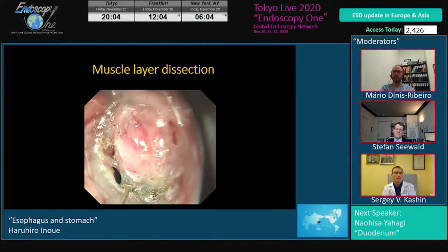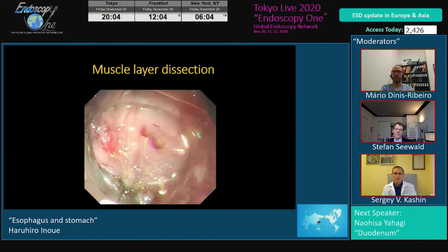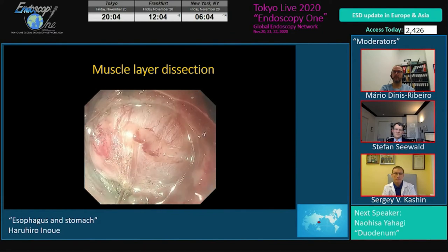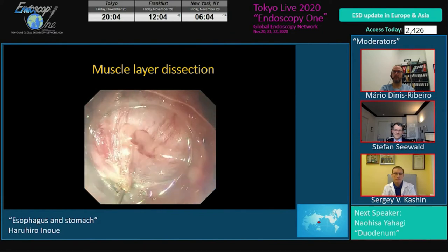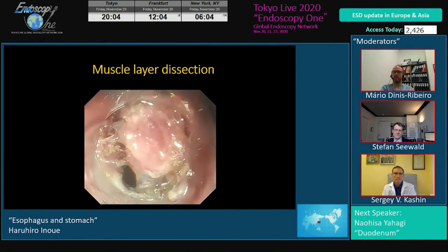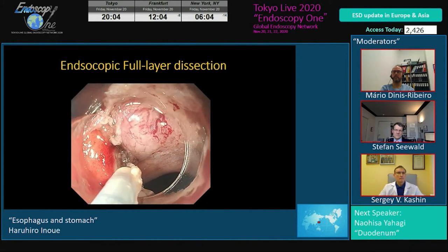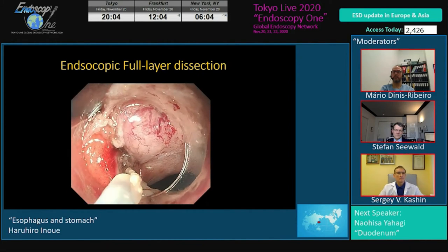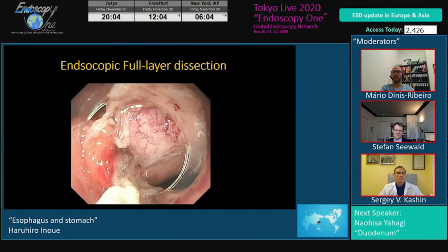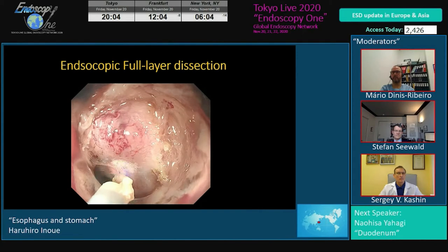Okay, in this case, this is the GIST tumor, FNA proven. Now we are dissecting some tissue. But at this moment, in this case, we have to do the full thickness resection, because now you can see the serosa outside. The tumor is almost exposed to the serosa layer. Size itself is not big.